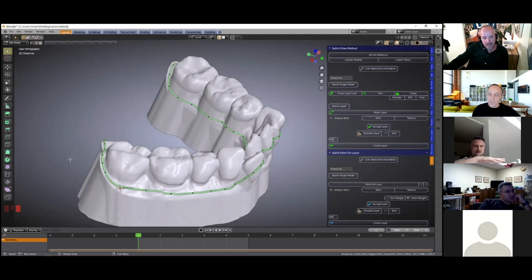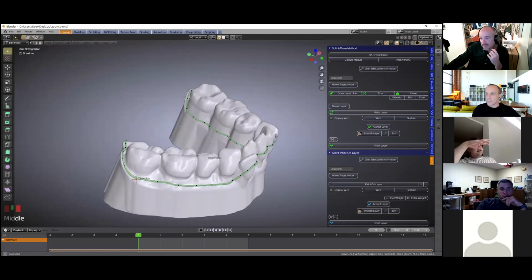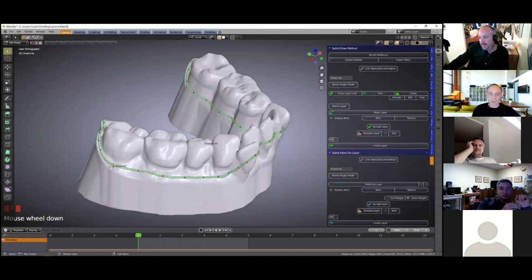But recently I started making the models, but I'm still not completely satisfied. Maybe something with the redesign which I'm using is not correct, or with the settings. I don't know, because I've done few tests so far. But this is the topic for after, because I might have a few more questions regarding the model design topic. Yeah, let's touch on that when Michael's done. We can go through those scenarios.